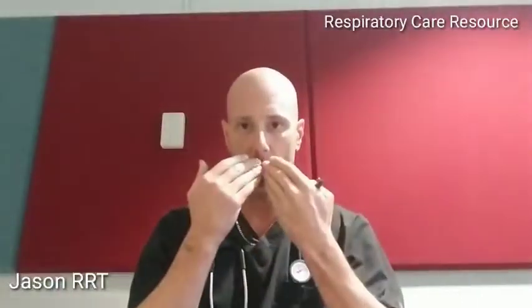So, you know, PEEP of 5, pressure support of 6, that little pressure support of 6 is to compensate for the resistance through the ET tube. We're breathing through a very narrow tube, okay? And we need a little bit of that pressure to compensate for the resistance. Don't forget that we have an ET tube, right? That's in the mouth. If we disconnect the ventilator, that tube is directly in the lung, okay? You can't close your glottis or anything like that. So you equalize the pressure.